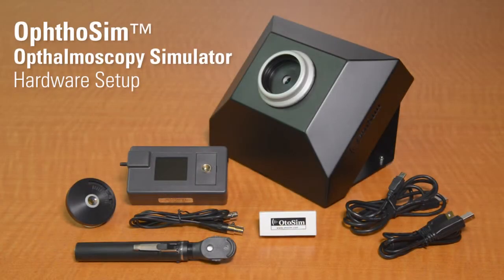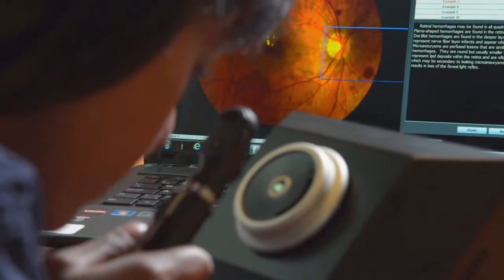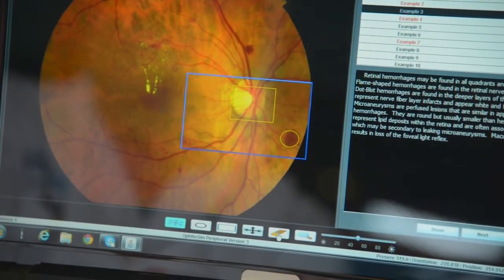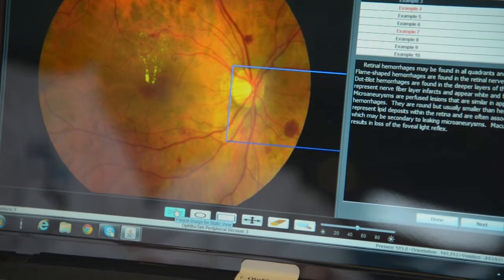In this video, we will demonstrate how to set up the hardware components of the OphtoSim. We recommend that you install the OphtoSim software before setting up the hardware. Please refer to the video segment on software installation for more details. However, you will require the fully connected hardware before you can access the OphtoSim software. Let's begin.